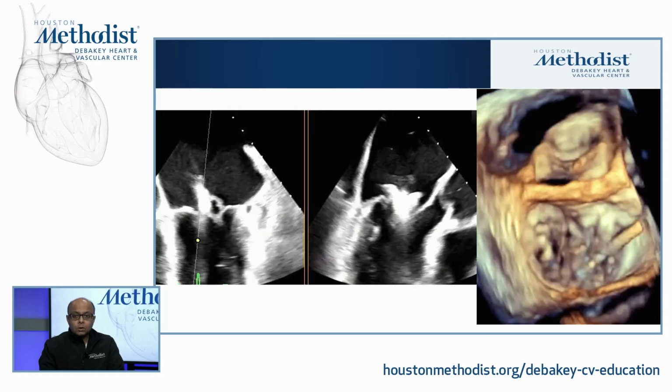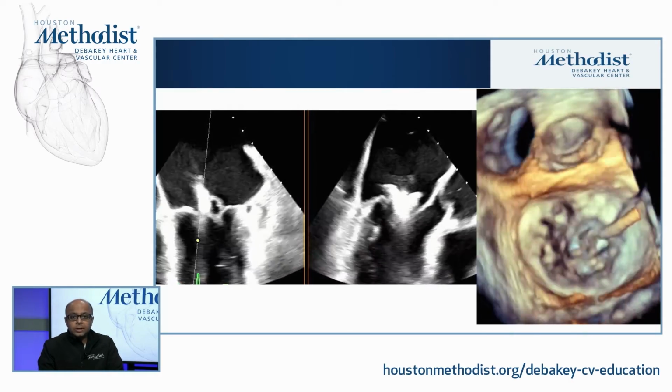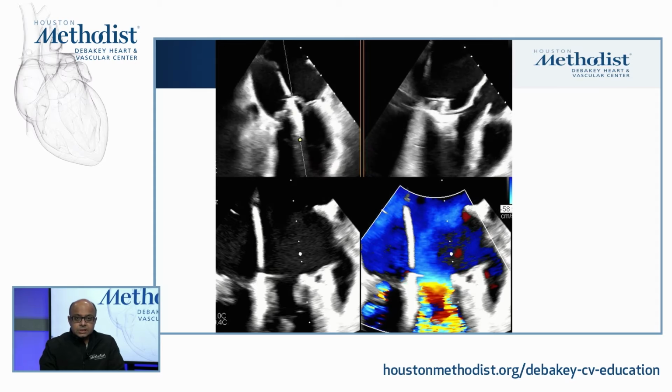It's still aligned 12 o'clock to 6 o'clock. So using the combination of 2D and 3D echo imaging, we can really cross the valve and stay perpendicular and line this up for success, as you will see in the subsequent slides.